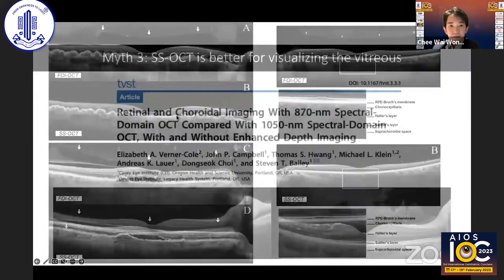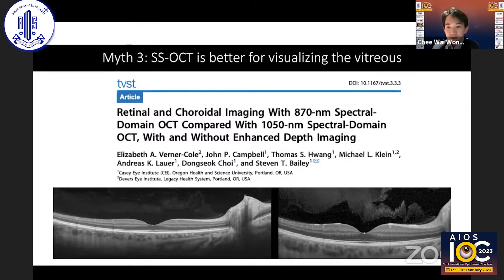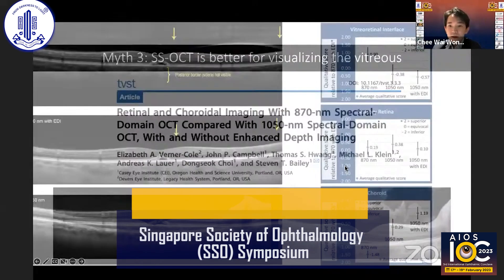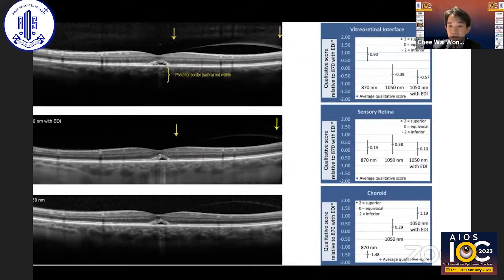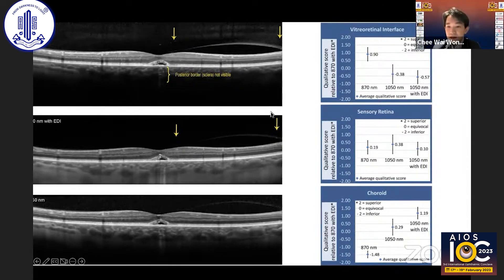Myth number three: swept source is better for visualizing the vitreous. The ability to visualize the vitreous is a function of the wavelength of light used. In this study, the authors compared spectral domain versus longer wavelengths in terms of imaging the vitreous and vitreoretinal interface. Vitreoretinal adhesion was clearest with 870 nanometers without EDI — so spectral domain appears to have the clear advantage here, although some swept source devices do offer a software-enabled enhanced vitreous visualization mode.